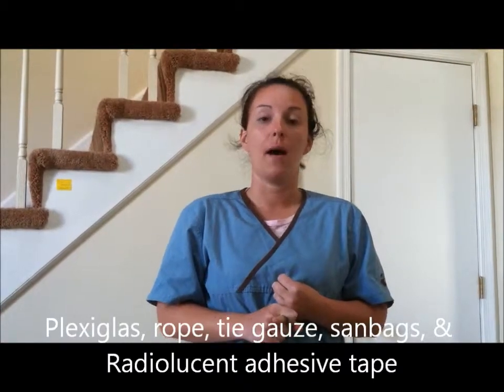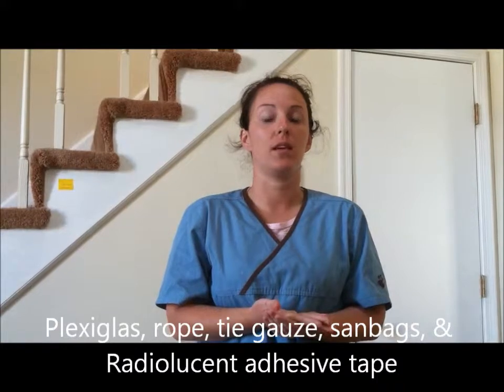The third type is the physical, which is used with devices. So you can use plexiglass, like I said earlier. Plexiglass can be placed in between the cassette and the patient. If you do that, you need to add 2 to 4 increase on the KVP. You can also use sandbags, rope or tie gauze, sheet, and radiolucent tape.